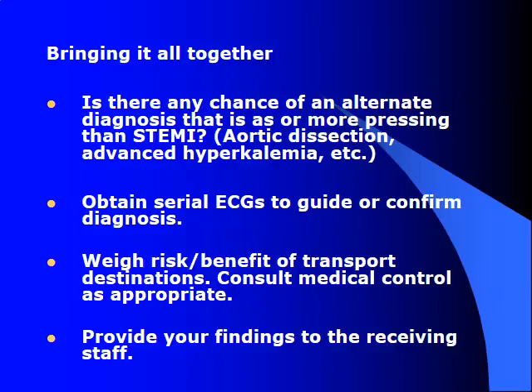We need to obtain our serial EKGs. That's going to really be a good indicator that guides and confirms our diagnosis. And then we need to weigh our risks and benefits of transporting to the destination, depending on what they may need. So it's always a good idea, if we have a question, to consult our medical control. And then we need to make sure we provide our findings to the receiving staff.